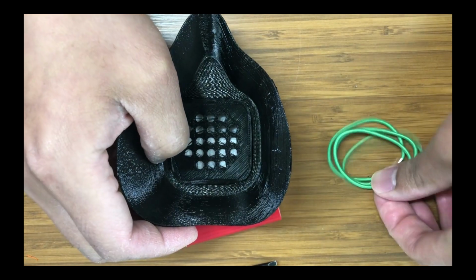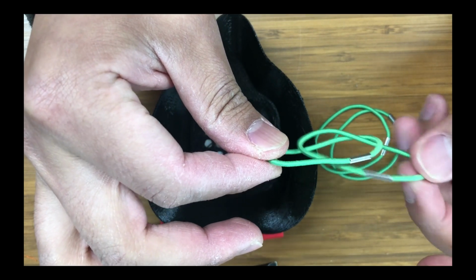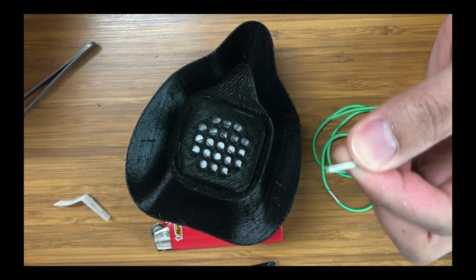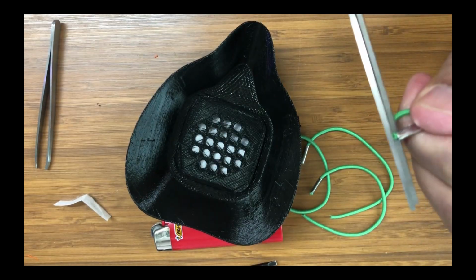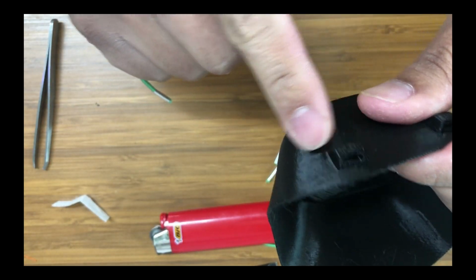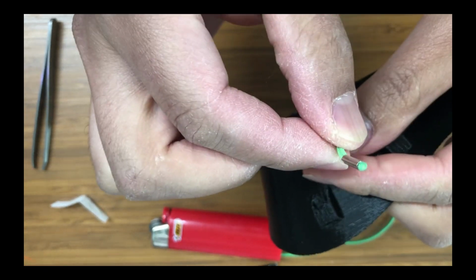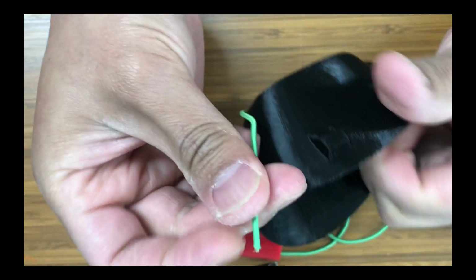Okay, the next step I gotta do is install these bands. Now these are basically hair ties that you can find at the dollar store, and I'm gonna cut them up right by the end where the metal part is, because I'm gonna use this to hold the band from slipping. I'm gonna cut all 4 bands right here. And then on the edge right here, we have these holes that you can fit the bands through, okay? So we're gonna start out from the outer one because we want the metal end, this metal end right here, to hang on to this part right here, as you can see. So we're gonna start out with this end.